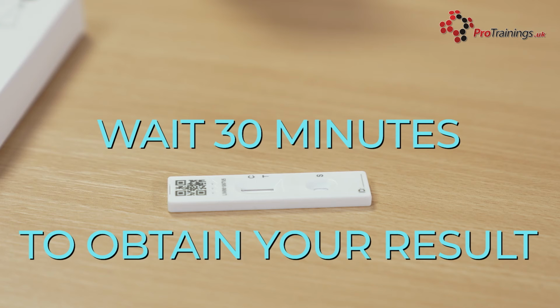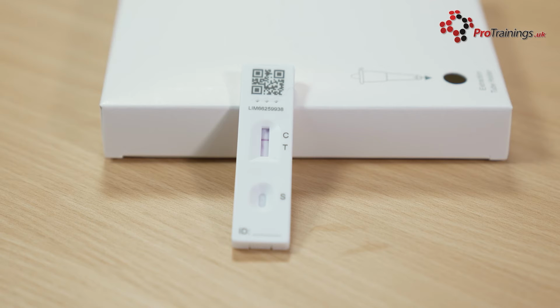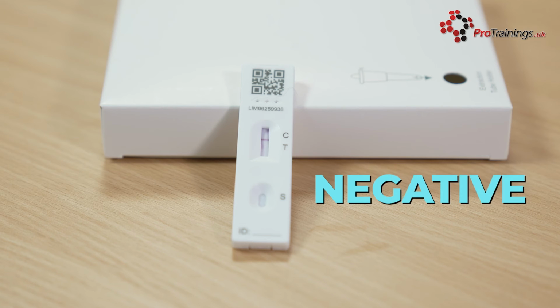Give the sample 30 minutes before you read the results. Waiting 30 minutes is very important. A positive result can show at any time after 20 minutes, but you must wait the full 30 minutes to show a negative result. With this type of test, a negative result will show a line against the C or control marking. A positive test will show a line next to the C and the T. One of these lines may be faint, but it's still a positive.